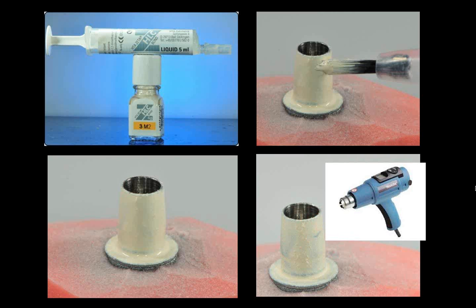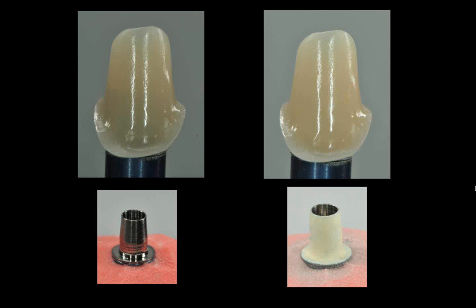And you can do that in a dental office. And you can do this on any abutment which you have. So if you have an abutment which is going to be cemented in the mouth, and you have a very thin crown, this is the only way you can mask it out. It's a fantastic product, never made for implants. This product was basically made for veneering metals with composite. I've been using it for this, and I hope VITA is maybe not going to discontinue it. By putting this on here, you can see this crown looks much lighter. If I don't put it on, you see the crown or the abutment looks grayer.